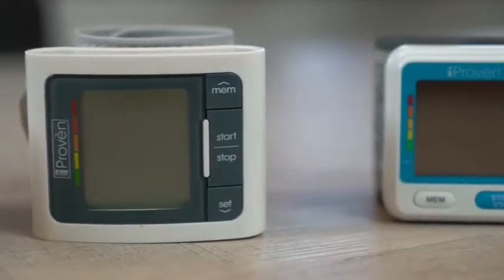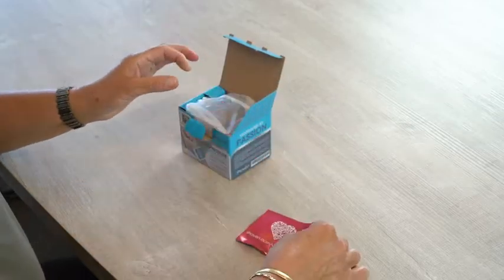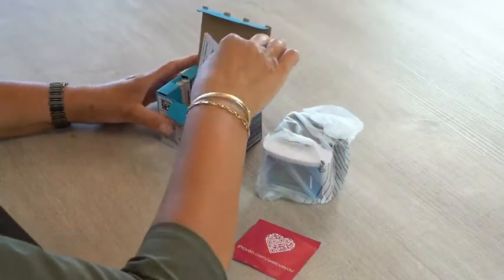Accuracy is vital when you want to track your blood pressure at home. In this video, we want to help you to prevent the most common mistakes when taking a measurement.